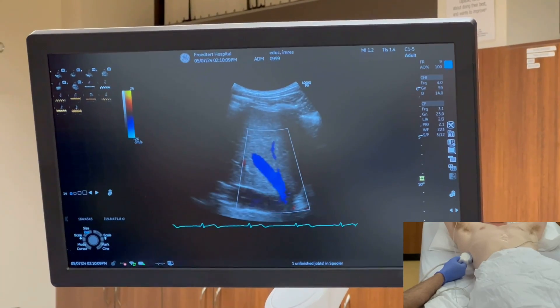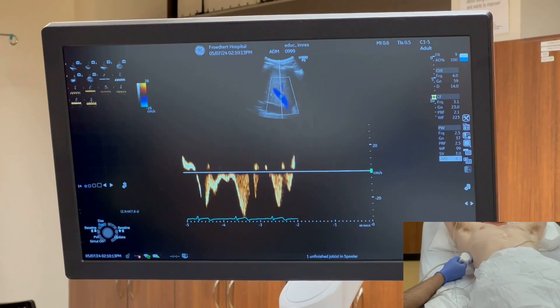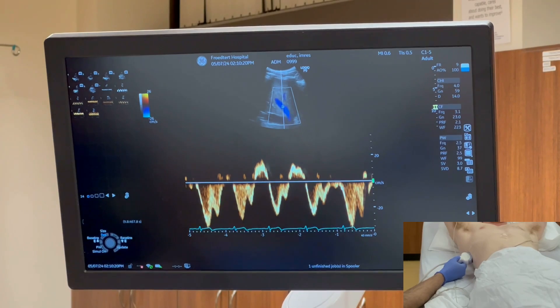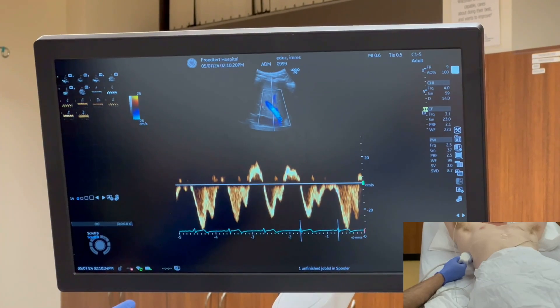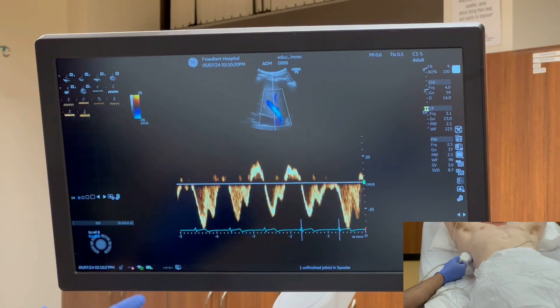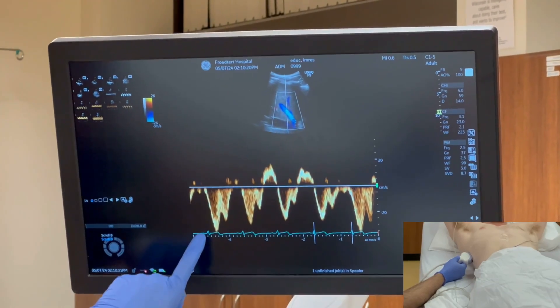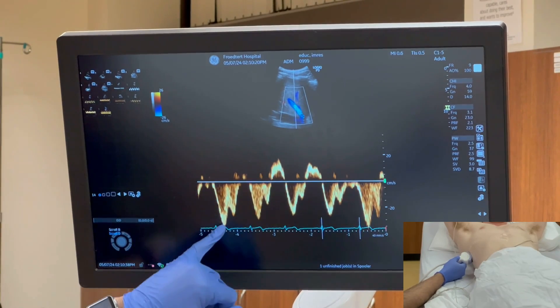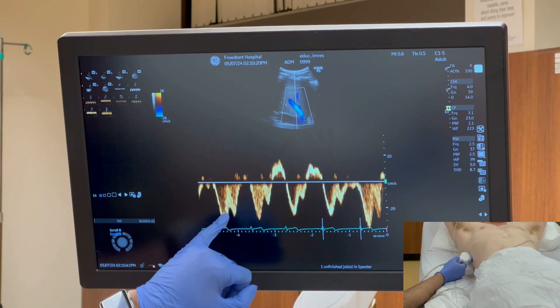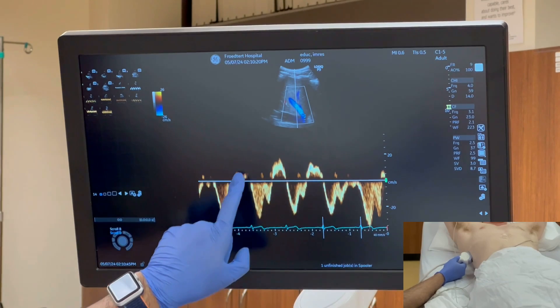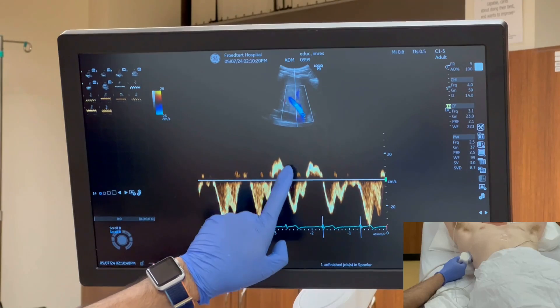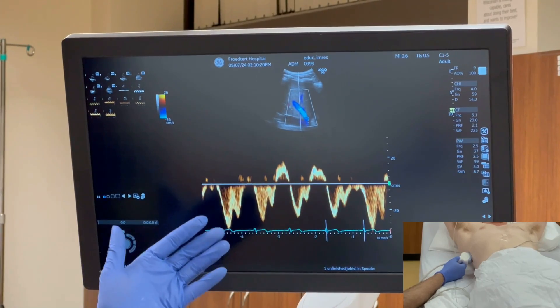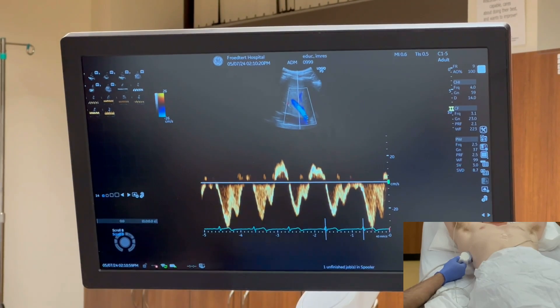I'll turn on the pulsed wave mode and get the sample volume to the middle of the vessel. The patient is breathing normally with quiet respiration and we got a tracing. If it is difficult in quiet respiration, you can ask the patient to hold their breath in expiration. With the EKG, you can identify where the QRS complex is — the wave following the QRS is the systolic wave, followed by a notch which is the V wave, then the diastolic wave, and a small A wave. This is a normal hepatic vein waveform.